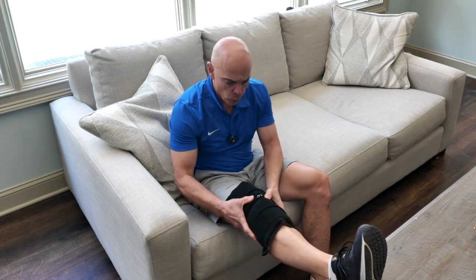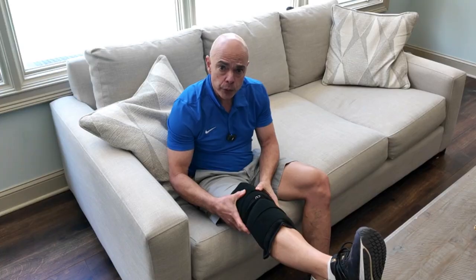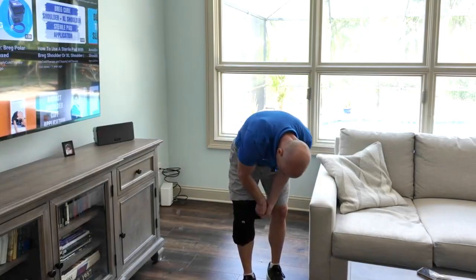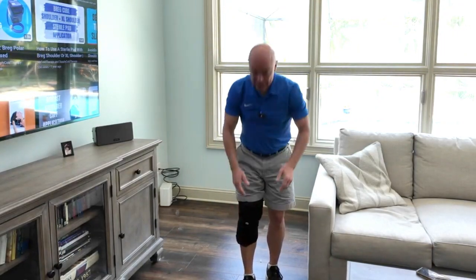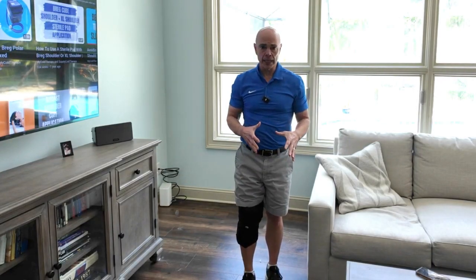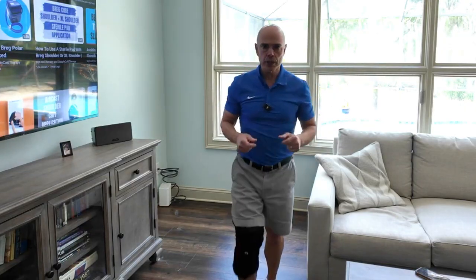Now, as I mentioned before, I'm going to test this out walking because this wrap actually is fairly stable. So now we're going to do the walking test. All right, it's time to do the walking test. So I got this thing cinched down pretty good. And as I said while I was sitting down putting the knee wrap on, these straps are amazing. Like, this wrap's not moving. It's a little tight, but you definitely can walk around in it.